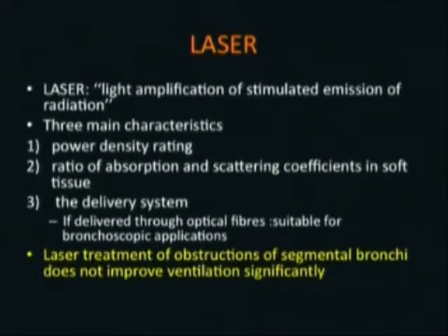What about laser? Laser is light amplification by stimulated emission of radiation. And laser has three main characteristics. The power density rating, so how much power, how much you are burning tissue, and how deep it goes into tissue, so how much is absorbed and how much is scattered around. And the delivery system, not all lasers can be delivered down in the airway. You just have to keep in mind that laser treatment will deal with obstruction but will not improve ventilation.